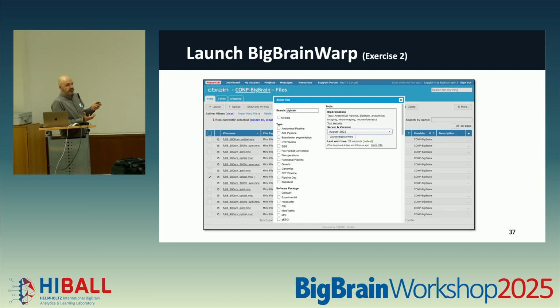But first, you have to select the tool you want to run on it. So again, there's a variety of tools that will pop up in your menu. You won't see the BigBrain one populated there at first, but that again is the search box where you can type in the BigBrain. That just because of the name of the tool we're going to run here. But you can see we have all the different types categorized. We have different flags that we've categorized each tool.